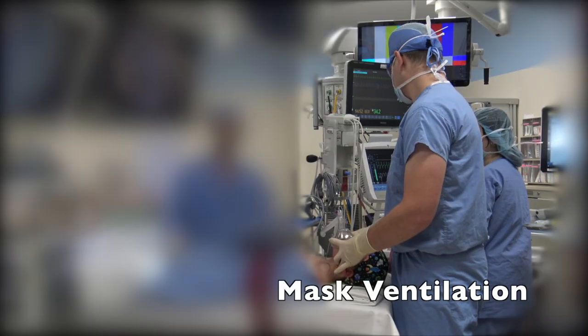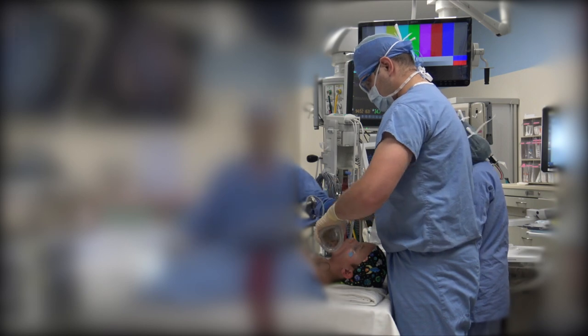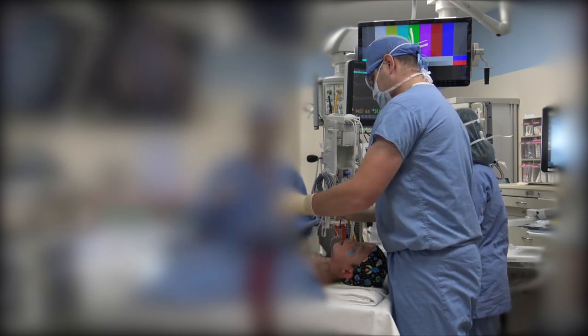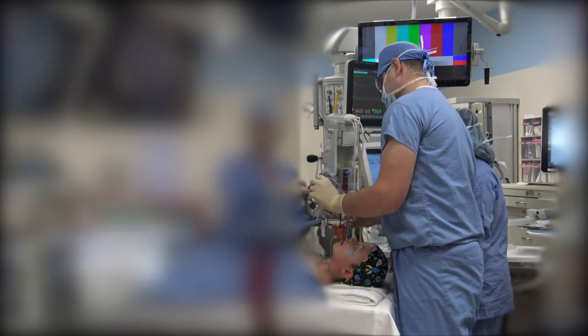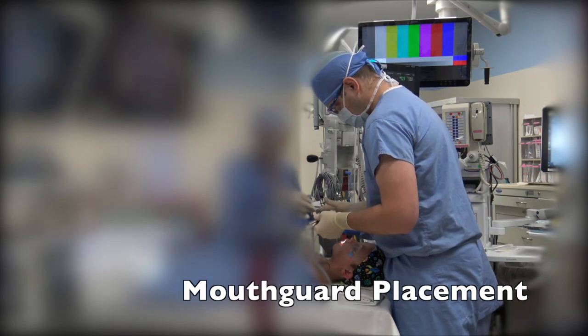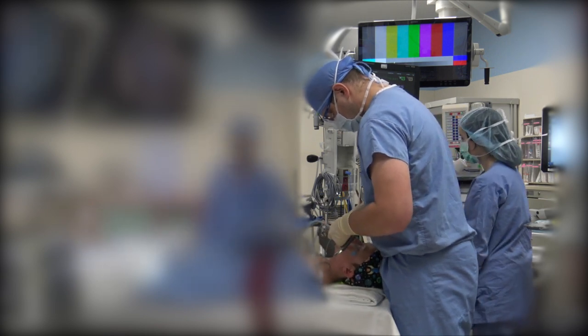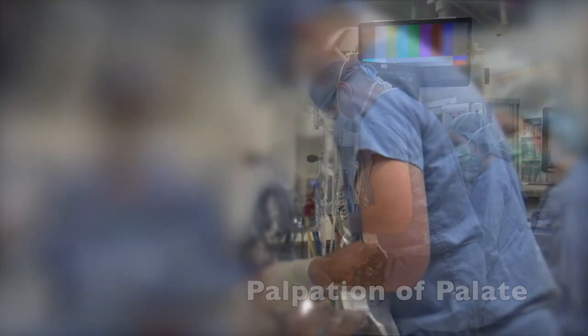First, the patient is placed on the operating table in a supine position. We ask the anesthesiologist to maintain spontaneous ventilation during the procedure. We always take care to place a rubber tooth guard or piece of gauze to protect the upper dentition or alveolus.